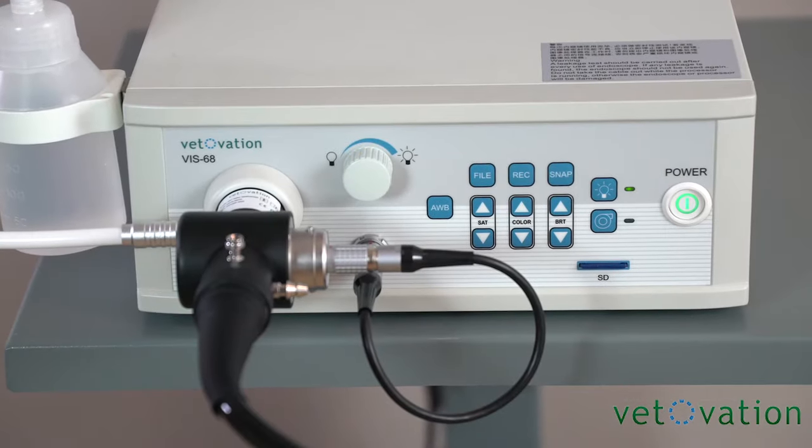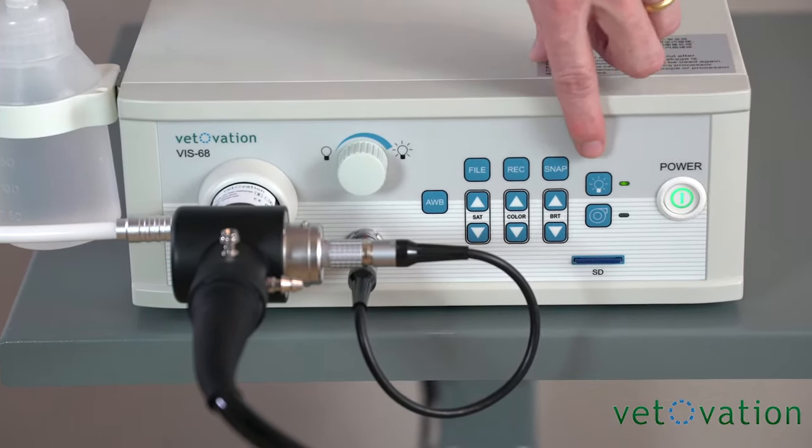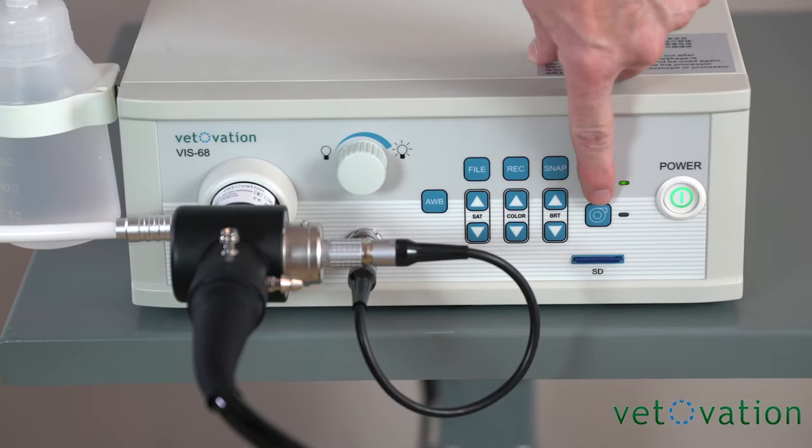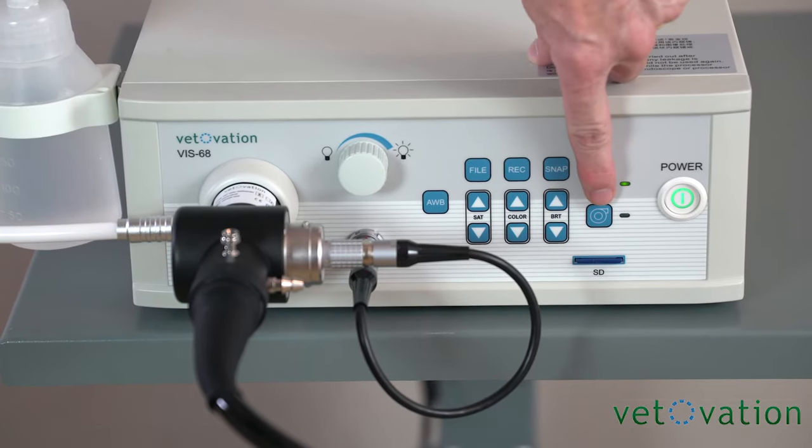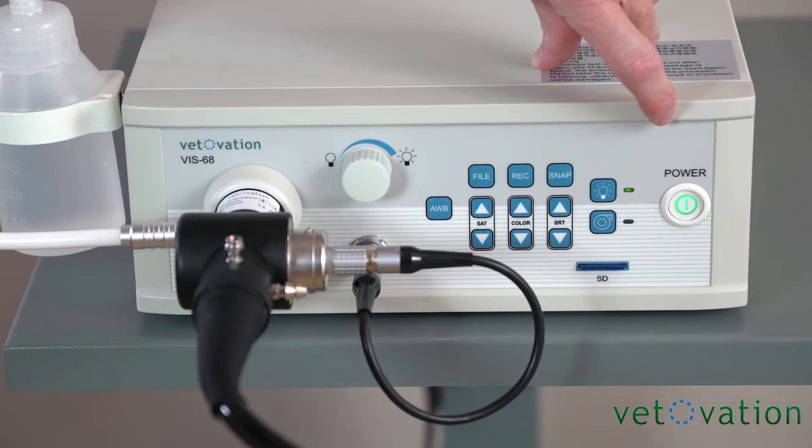The high-definition gastroscope system is very easy to use. Once the system is powered on, turn the light on, turn your pump on. The pump controls fluid and air going into the scope and into the patient.